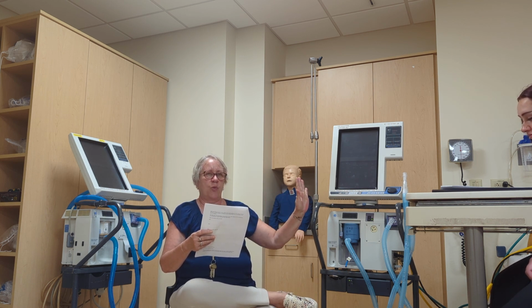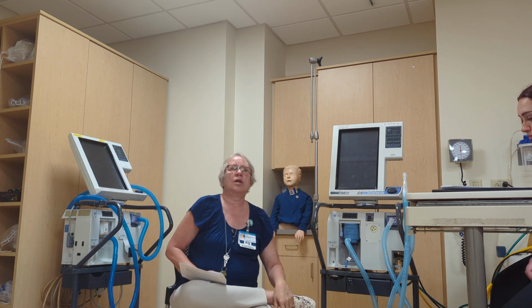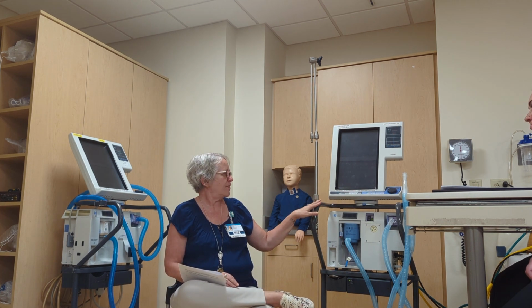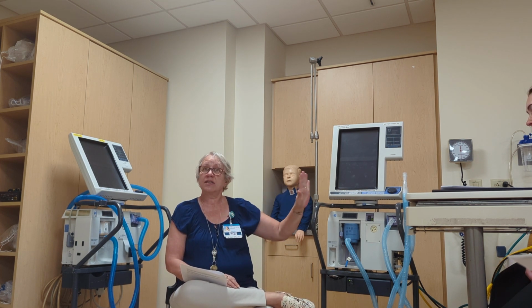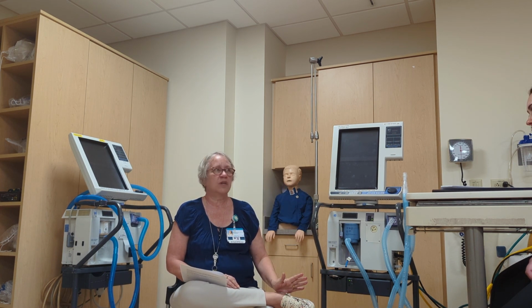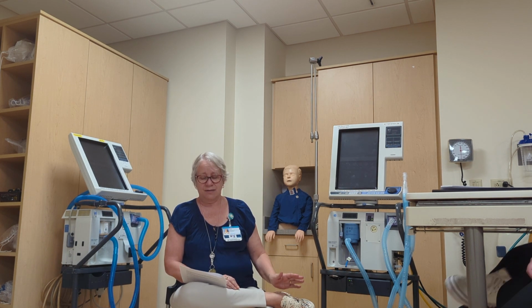What you're going to do is set your ventilator to the lowest tidal volume, 100 or 200. These vents, I think we can get them to 200. We're going to set this before you put the patient on. This would be if you have a machine that doesn't have an SST on it. Does that make sense? But your boards are going to ask you about this, all right?